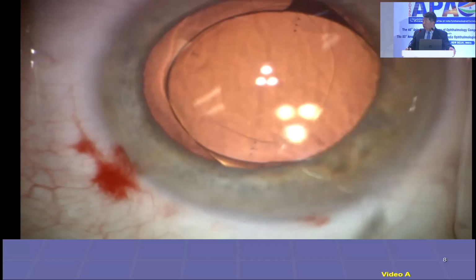Faculty? CTR? Yeah. Amar? Stop and do PRK. Amar's going to take it out and put in a glued IOL. Amar says rotate it back to 180 and do a surface. All right. What I would do is cut the haptics and place a new IOL in the back. Take it out, okay. Yeah. But it's not fibrotic, and remember that the beauty of that formula is you know it's the right power and the right toric power. It just is the wrong axis. Okay, but you would put in a spherical or a new toric? A new toric. New toric, okay.